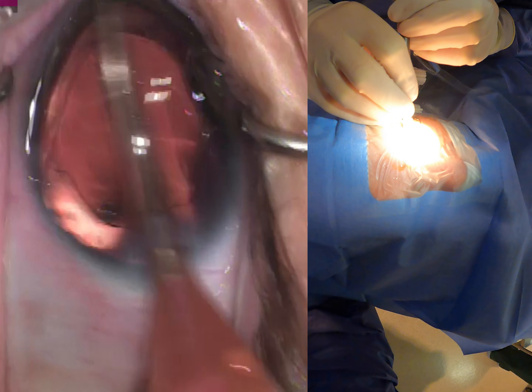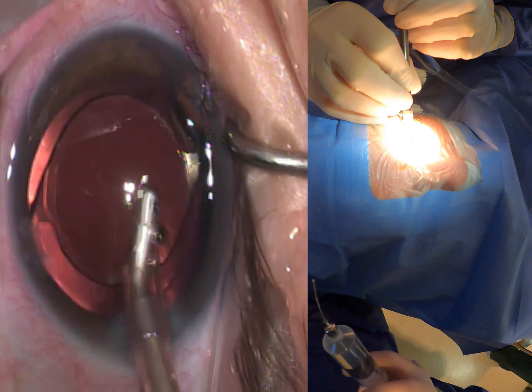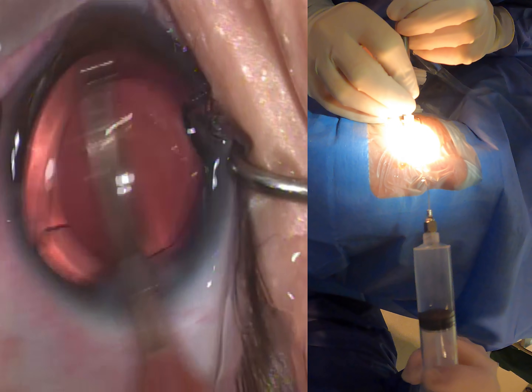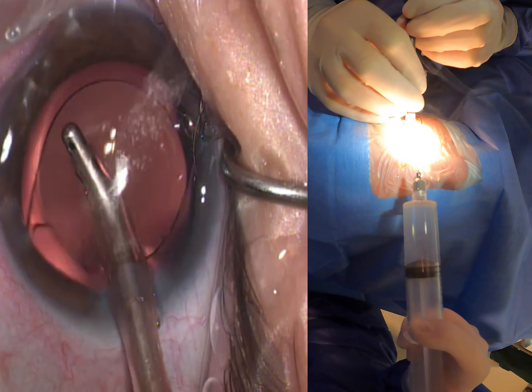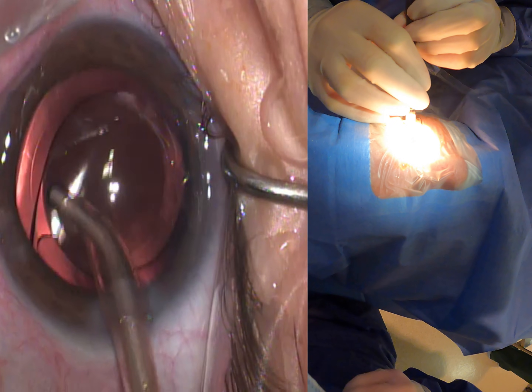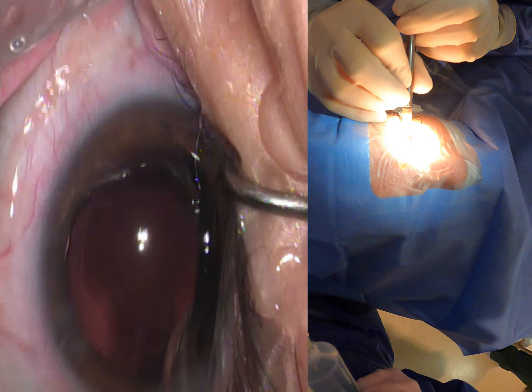It does increase cartridge size around the 25 diopter mark, so when you get to 25 diopters and higher it does require a slightly larger wound. I run through a 2.2 millimeter incision, so if I do use those slightly higher-power lenses I just enlarge my wound to a 2.4.